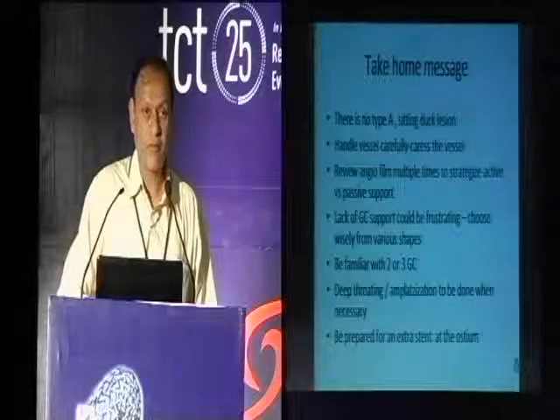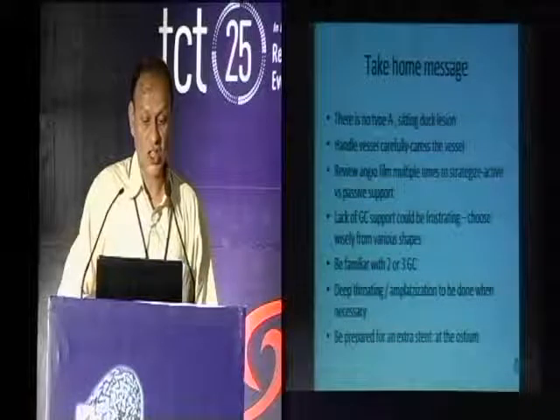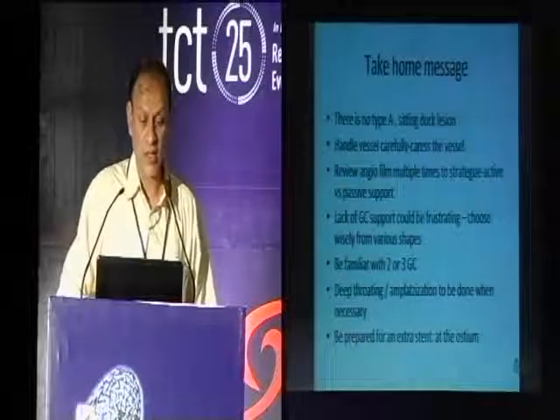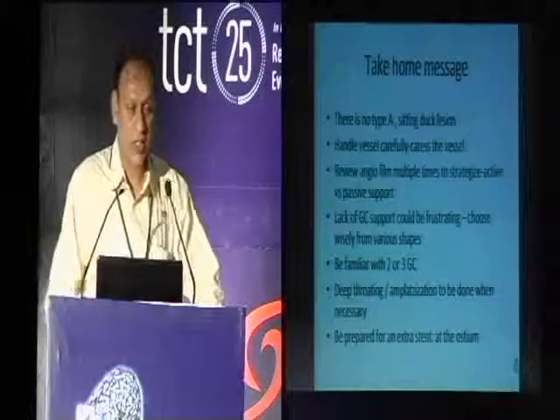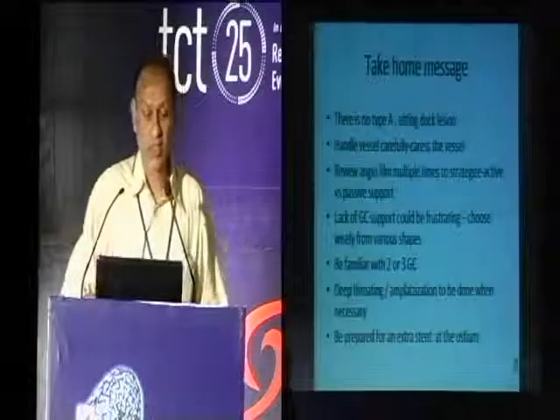Handle the vessel carefully. In fact, my boss says, caress the vessel and treat it with a lot of respect. Review the angiofilm multiple times before you think about the strategy of active or passive support. Lack of guiding catheter support could be frustrating. Choose wisely from the various shapes.